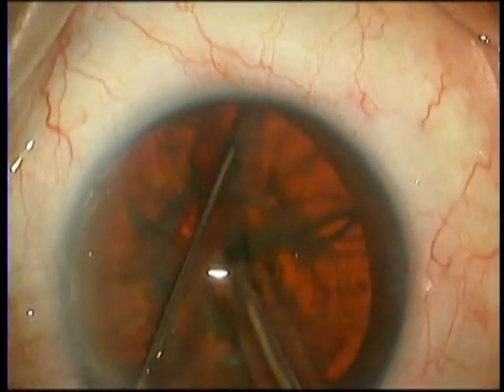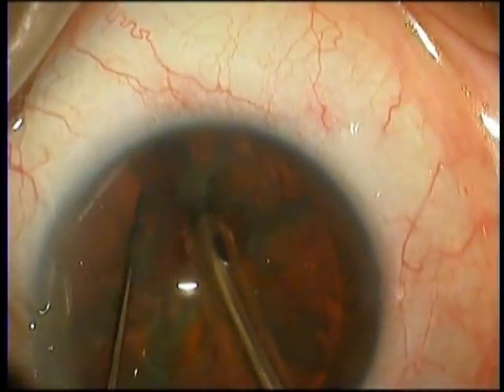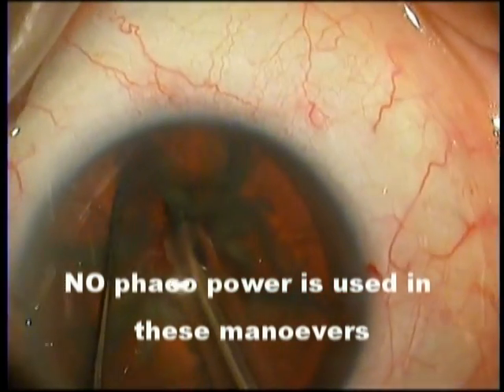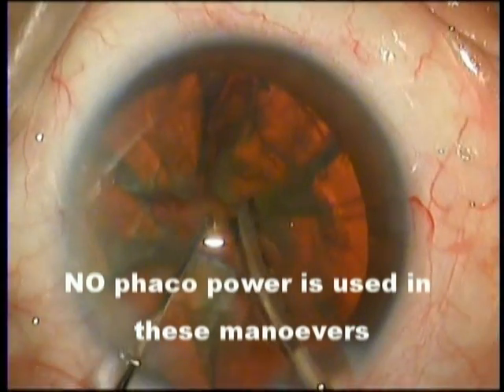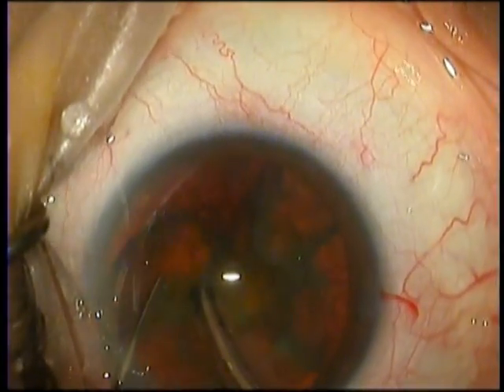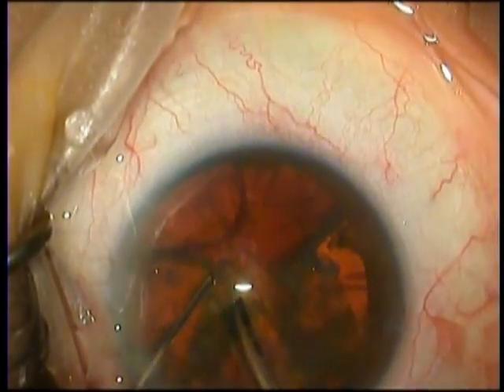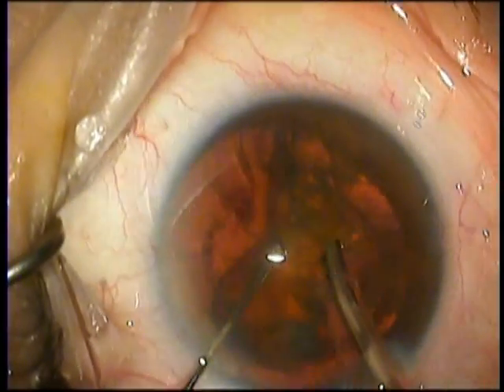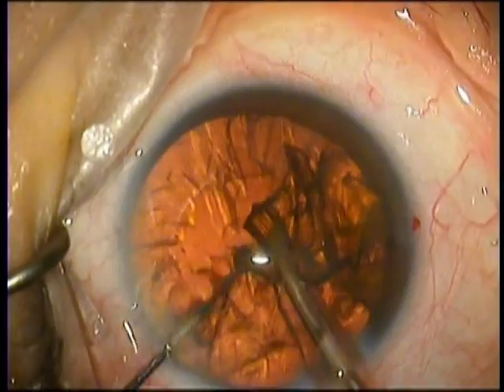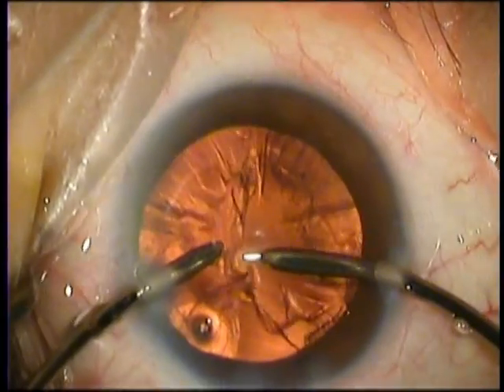The danger is that we do not chop deep enough and we tend to get very superficial scratches in the surface of the lens, in which case it will not crack. If you notice here, I am chopping deep and we are coming towards the phaco tip and actually touching the phaco tip. Also note that we are not using any phaco power during this step. Now the lens has been chopped into six different quadrants and it is now being phaco aspirated into the phaco tip. We are using the Orzil phaco handpiece with the Alcon phaco machine. This whole step from beginning to end, from the beginning of the surgery till this point in time, has just taken 4 minutes and 15 seconds.